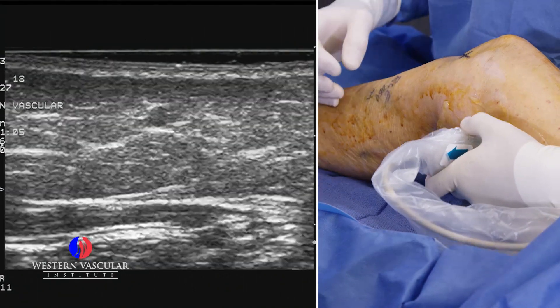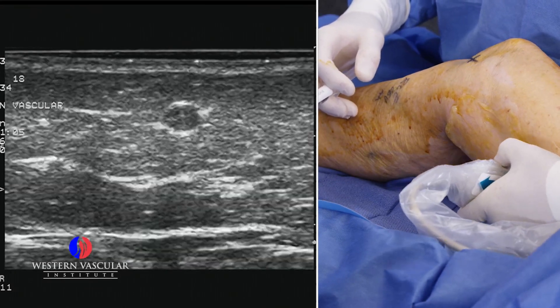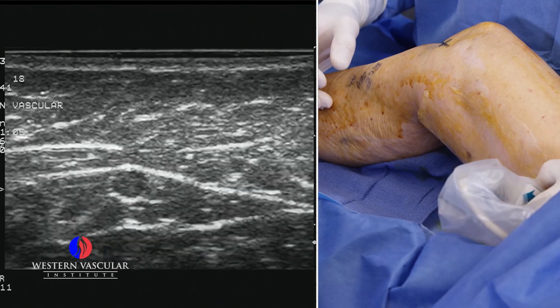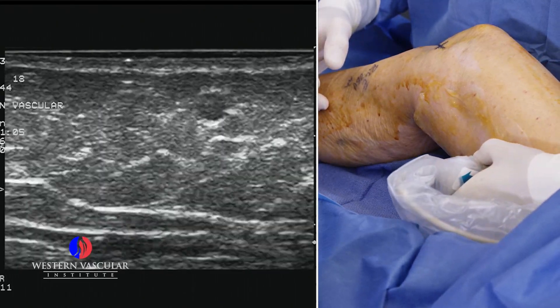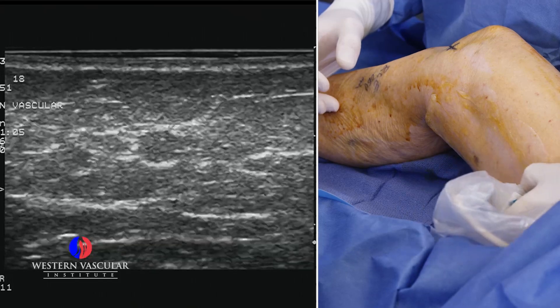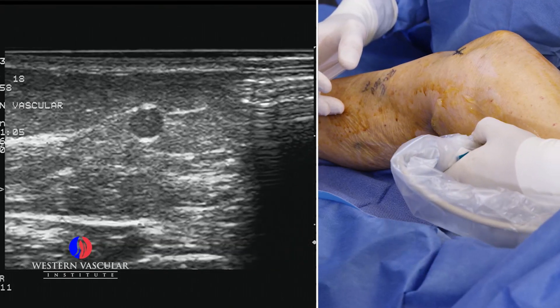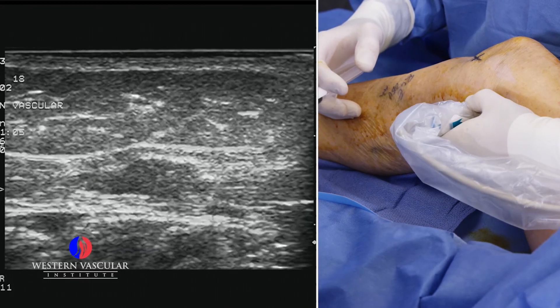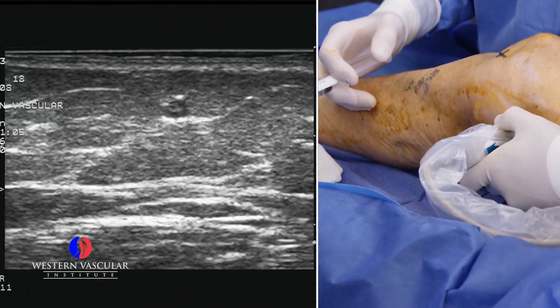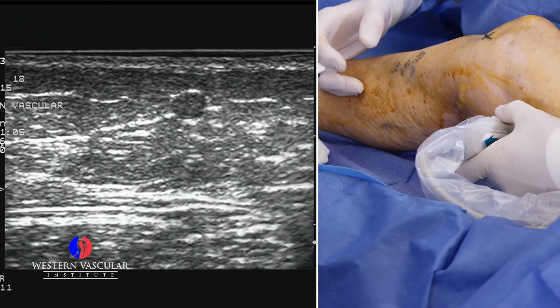What we see here is a dilated greater saphenous vein — I'm compressing it with the ultrasound. Within this vein are incompetent valves, which you won't be able to see with this ultrasound view, but it is an abnormally dilated and incompetent vein. Not all the valves are incompetent — our ultrasound technicians assess each set to determine which ones are. At some point there will be competent valves, and I'd guess the vein toward the calf has a competent system. We want to target the incompetent, dilated portion with incompetent valves, and this looks like a good area to start entry into the vein for the ablation.